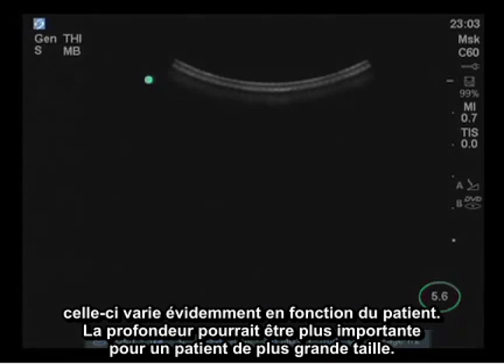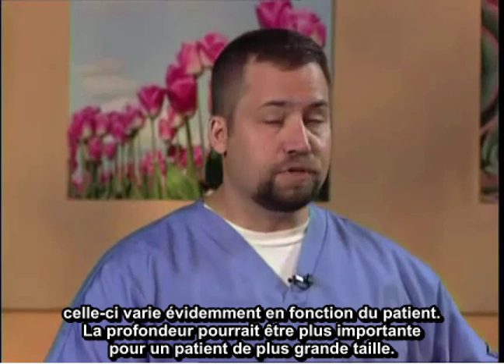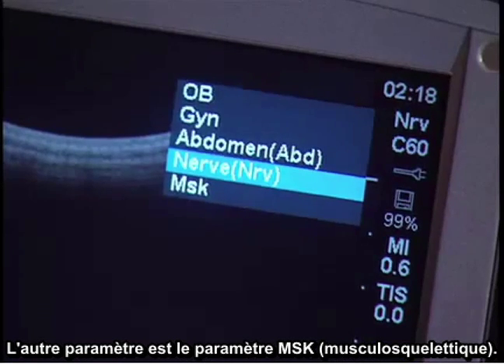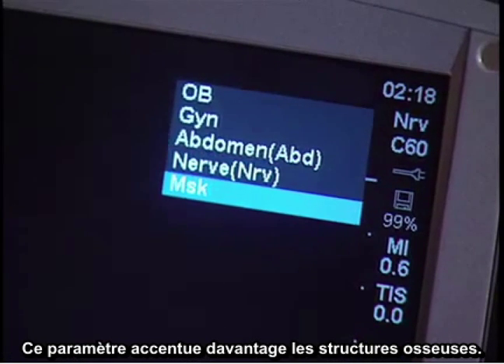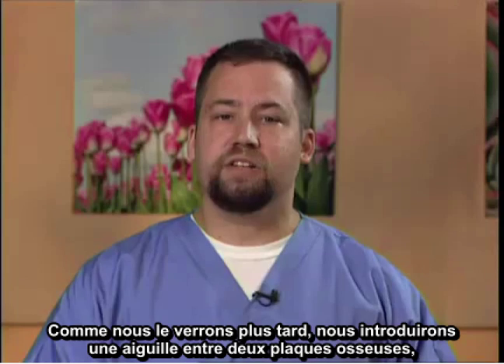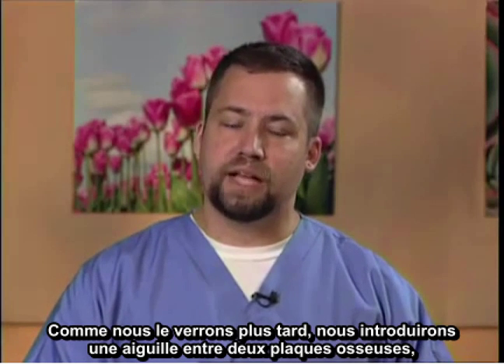The settings are set for 5.6 cm depth. Obviously, this is patient specific — a larger patient may require a deeper depth. The other setting is the musculoskeletal setting, or the MSK setting. This provides the best bony enhancement, and as we'll see, we'll need to be passing a needle between two bony plates, and this setting facilitates the best view of this.